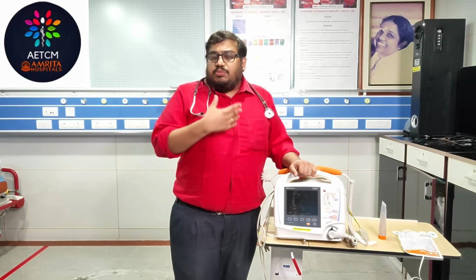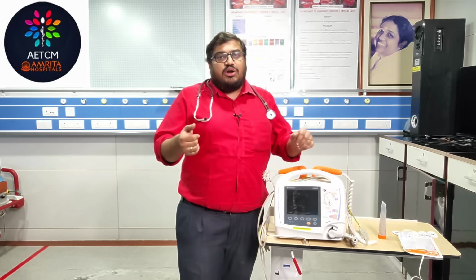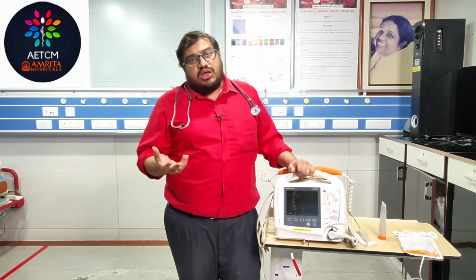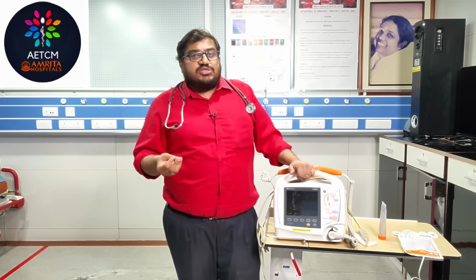Maybe if there is very much chest hair, it might not deliver the shock properly. Maybe you need to clean that area, deliver the shock, and see how the patient is responding or not.